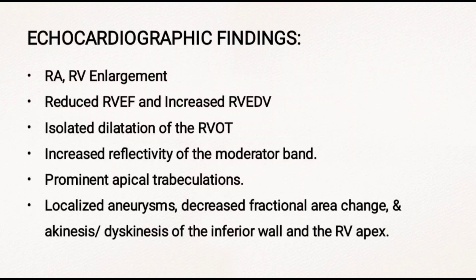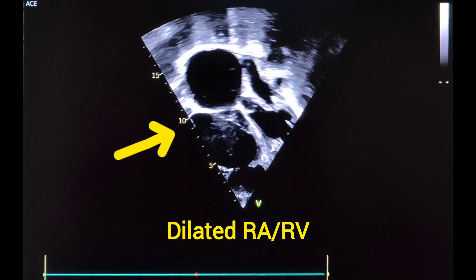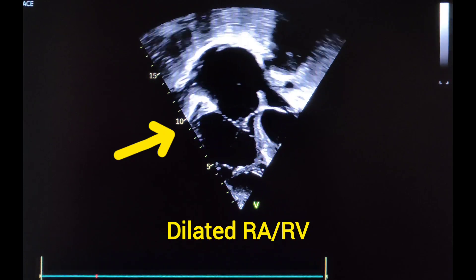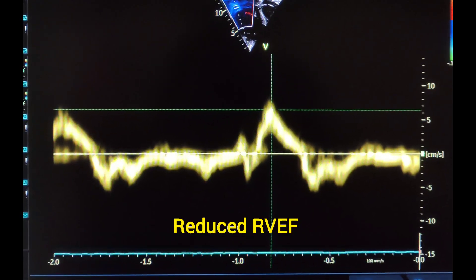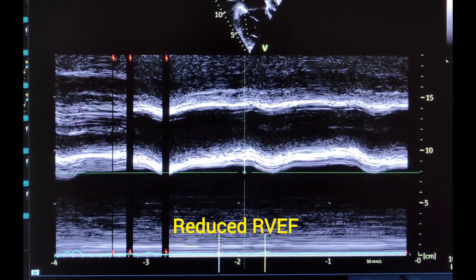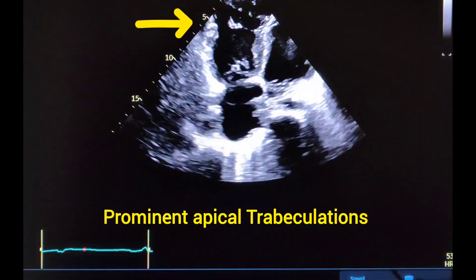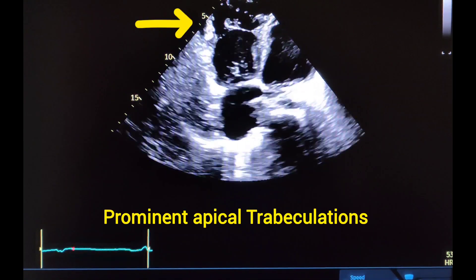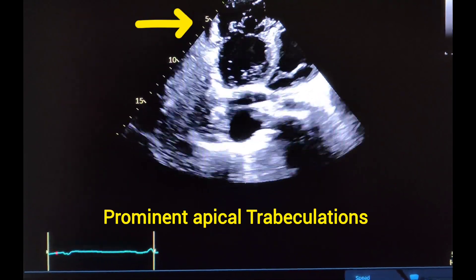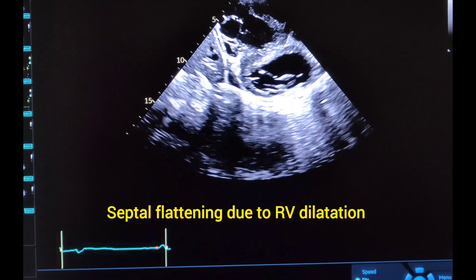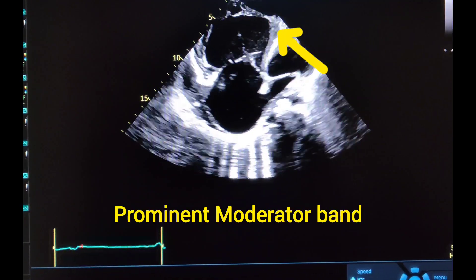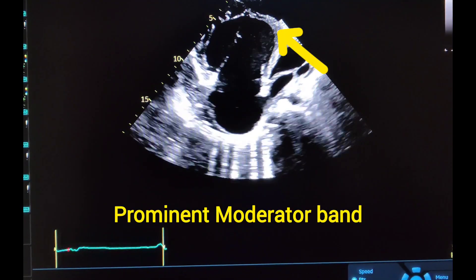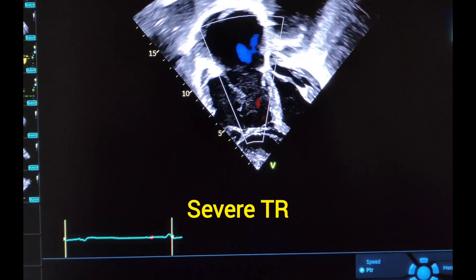For better understanding, let us have a look at the real echo images. As you can see here: right heart dilatation and reduced RV TDI S wave and TAPSE indicating reduced RV function, prominent apical trabeculations, septal flattening due to RV dilatation, prominent moderator band, and annular dilatation causing severe TR.